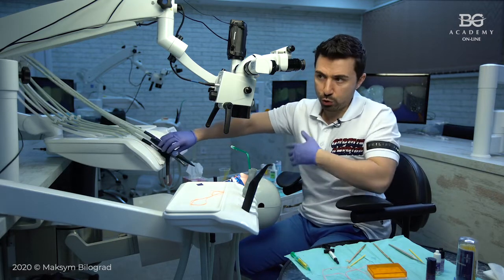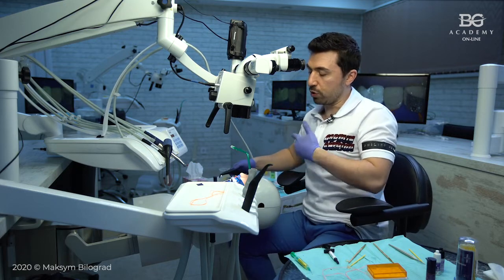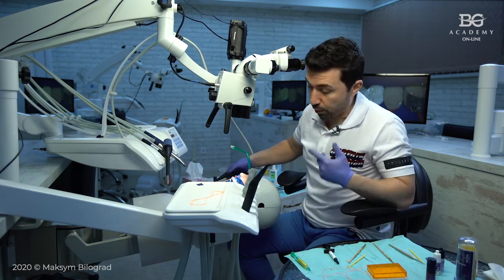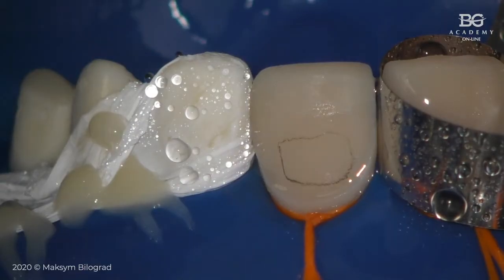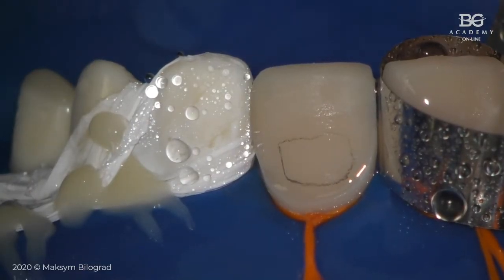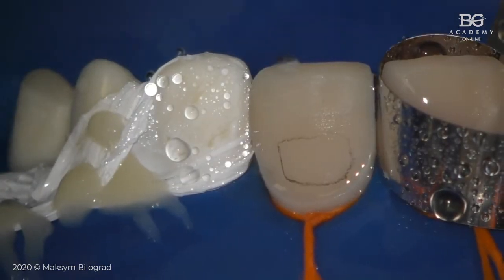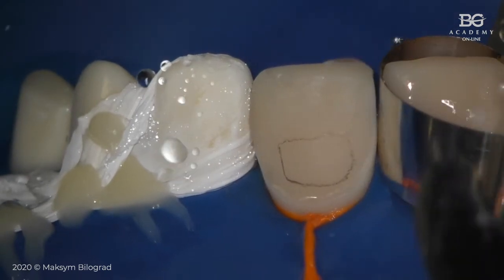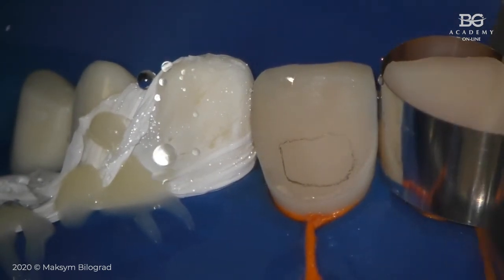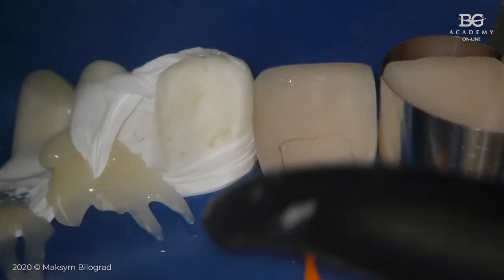So let me show you how I dry, if I'm doing total etch process. So I just dry the rubber dam. I'm just drying the rubber dam. See, I'm not drying the tooth. Then I'm drying adjacent teeth. Adjacent teeth.